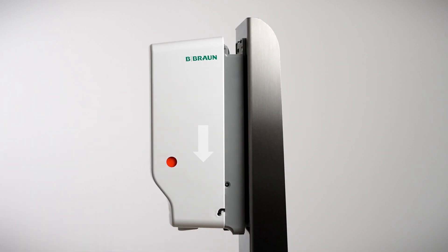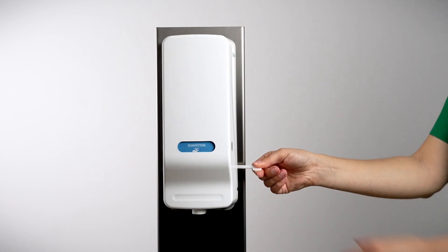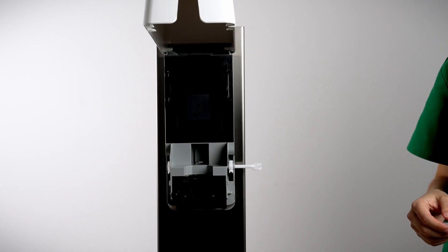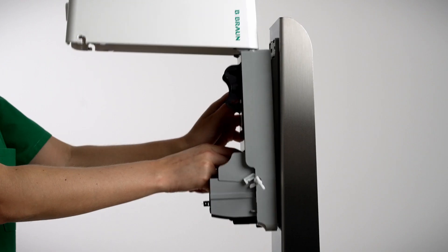Make sure you hear a click so you know it was done correctly. To remove the wall dispenser, open the cover and remove the bottle with a twist. Press the tab in the area below the battery case and at the same time push the dispenser upward.